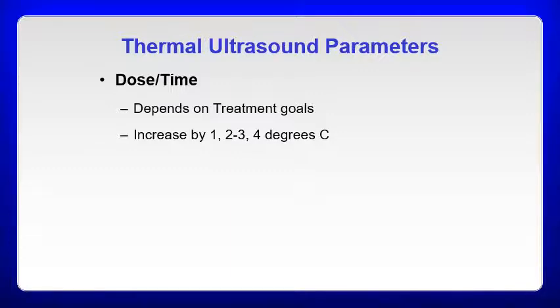Essentially, you will still get the benefits of the other temperature levels. In other words, you're still going to increase metabolic activity, obviously, because you're still raising the temperature, and you're still going to reduce chronic pain and spasm because you're exceeding that 2 to 3 degree increase. Okay, so they're not mutually exclusive. As the temperature goes up, you're still getting the effects of the lower temperatures.